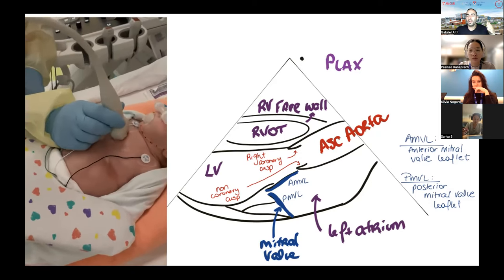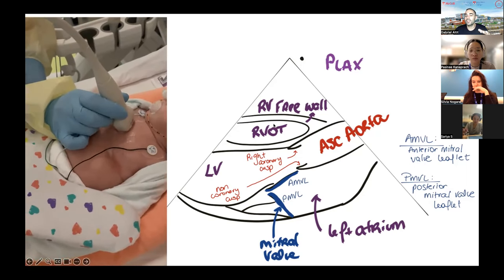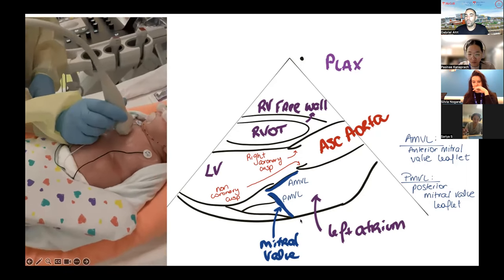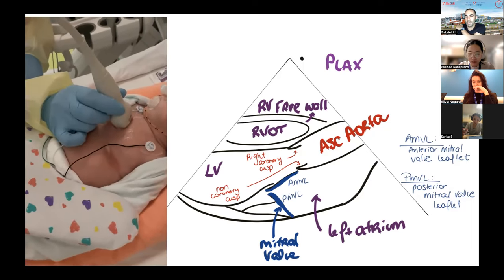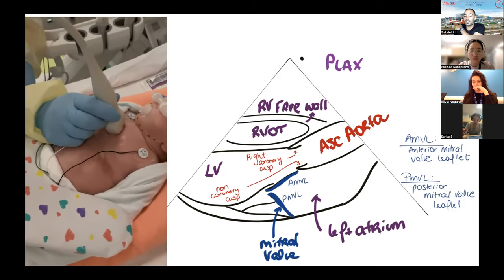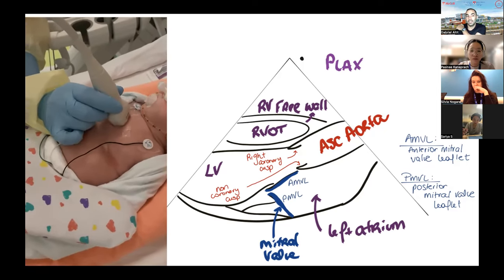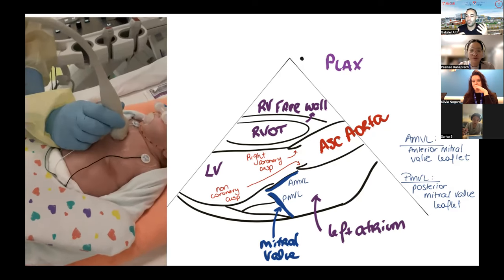Okay. And it's important we have the same language. I'm putting what's the most conventional language of how we speak about the anatomy of the heart. Although Pacini, I think you remember you did a session with Dr. Villon, where she clarified that the nomenclature is sometimes a bit more fluid than what we think and probably will be evolving with time.